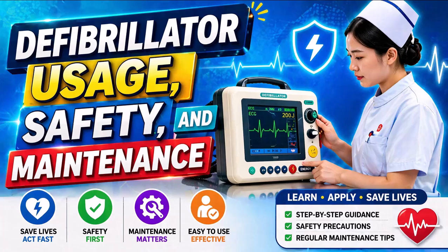In today's listening session, we will discuss an essential life-saving medical device used in emergency and critical care settings, namely the defibrillator. This device plays a crucial role in restoring normal heart rhythm during life-threatening cardiac arrhythmias, particularly ventricular fibrillation and pulseless ventricular tachycardia. A defibrillator is a medical device designed to deliver a controlled electrical shock to the heart. The purpose of this electrical shock is to stop chaotic electrical activity in the heart and allow the heart's natural pacemaker to re-establish a normal rhythm.